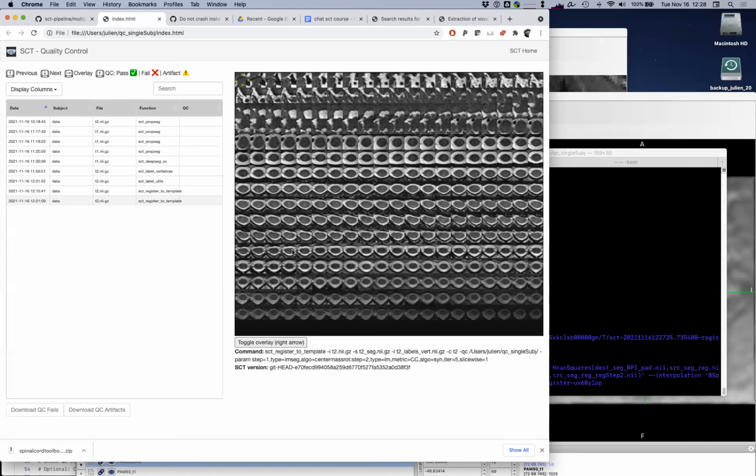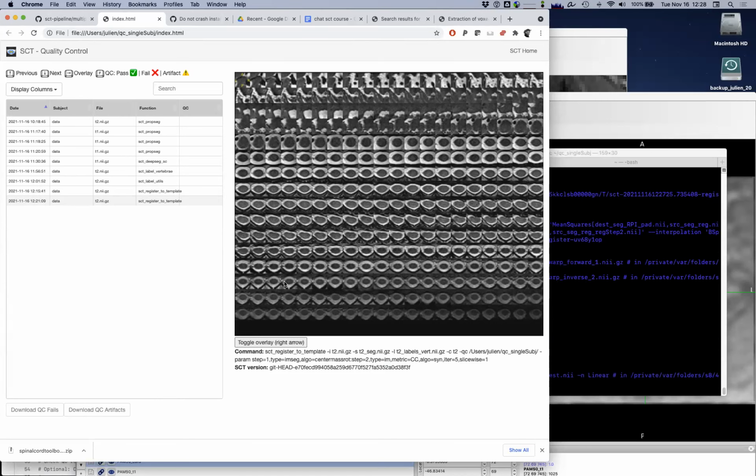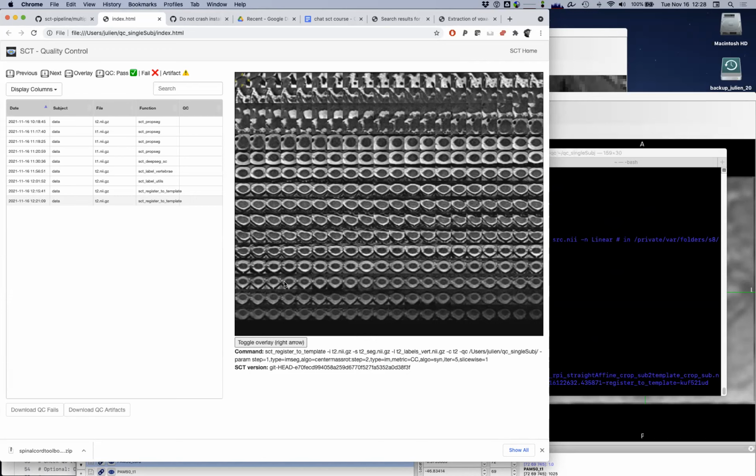If you have 5,000 subjects to deal with, you want to have a pipeline that is as robust as possible, right? So let's say we use the default parameters and we only modify the iterations. Instead of the default 3, we use 5. Yeah, that will minimally affect the results. Exactly. Thank you.